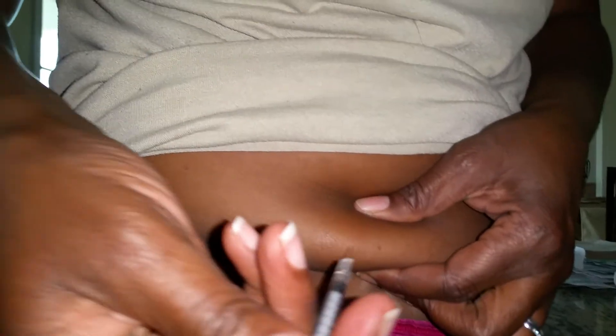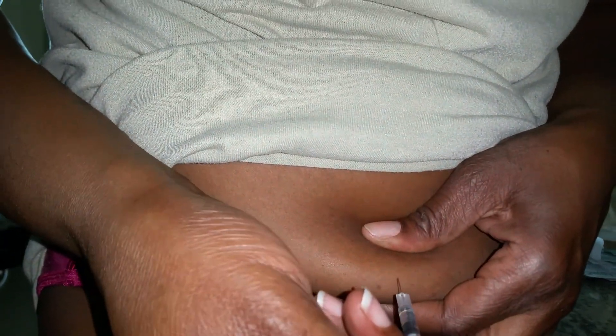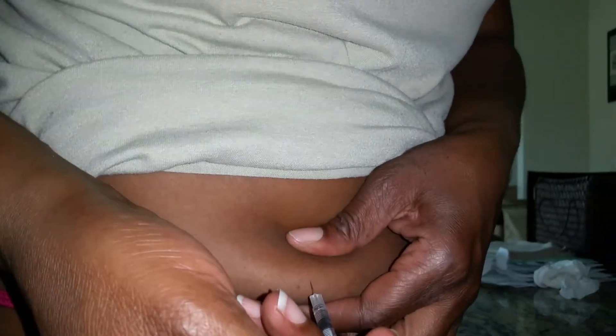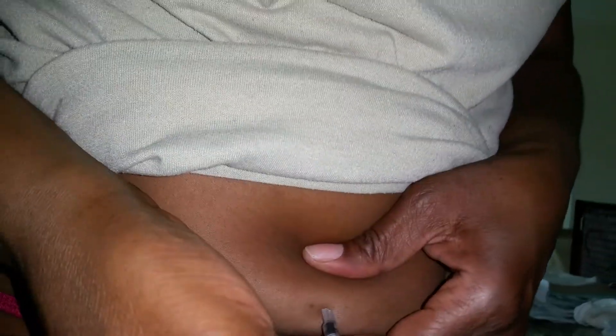She's going to grab her needle. This morning she needed help; now she knows this is just a little prick. She inserts it at a 90-degree angle and pushes it all in. We wait for five seconds, grab our gauze, and then she pulls out.